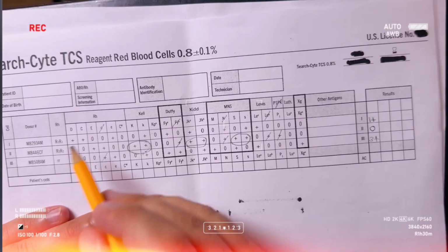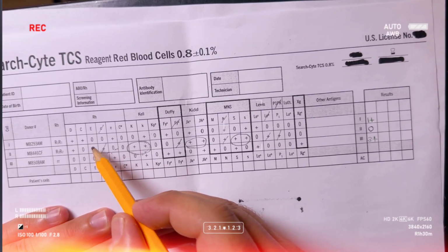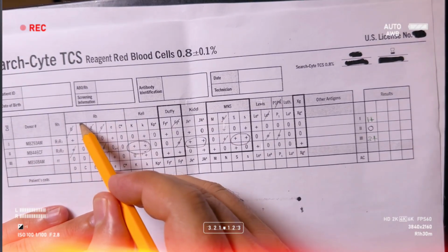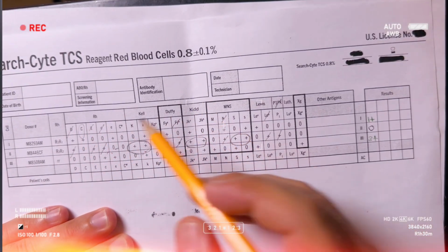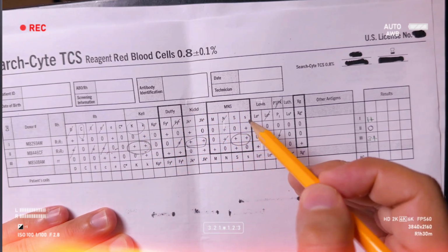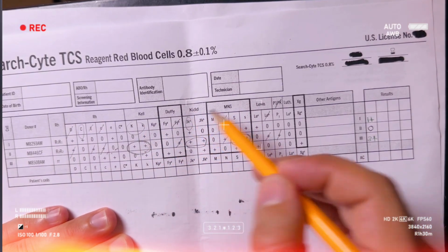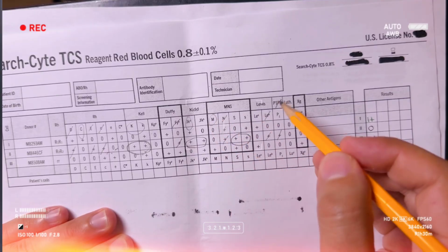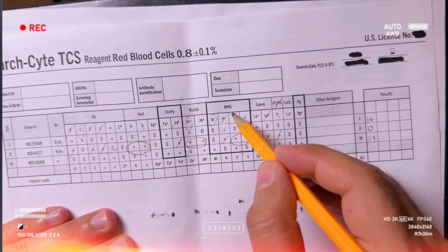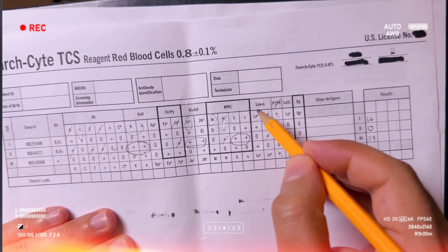I rule out little c, and E, and D are also ruled out. So what is left? Big C, Kell, JKA, M, and S, and Lea.